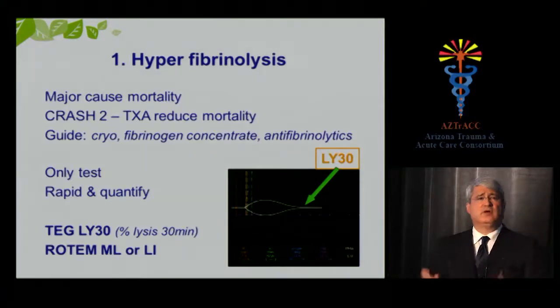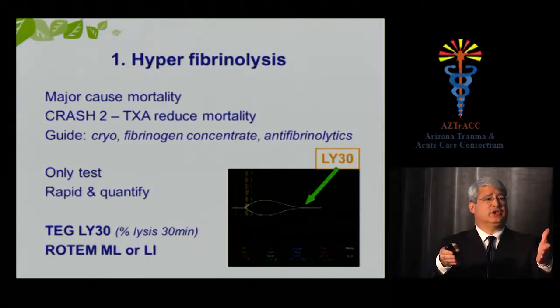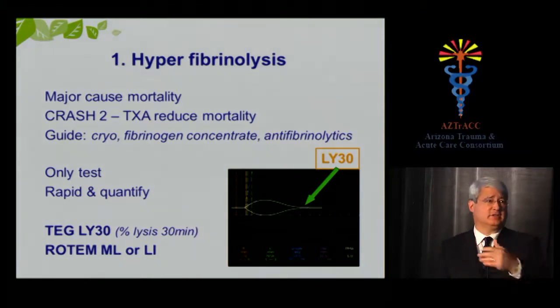Okay? So hyperfibrinolysis. There's no other test that measures hyperfibrinolysis in practice. There's no other test that you can use during initial resuscitation of a traumatized patient that will tell you, yes, this patient is lysing the clots it's forming too fast, pathologically fast, abnormally fast. Okay? And we know that hyperfibrinolysis is bad. It's not good for your patients.